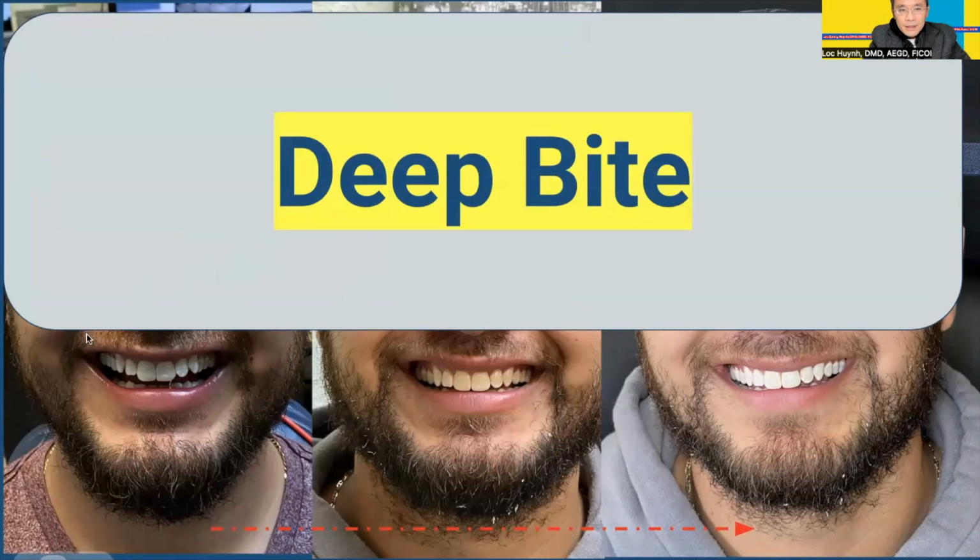So from here, even though he could smile, you can see it's a little bit uneasy, not a natural smile, but here it is a completely nice, handsome-looking smile with more evenness on the top. It allows the lower lip to rest exactly on the incisor edge of the teeth, rather than this one, not knowing where the lower lip is supposed to rest.